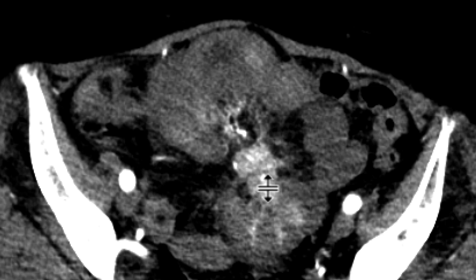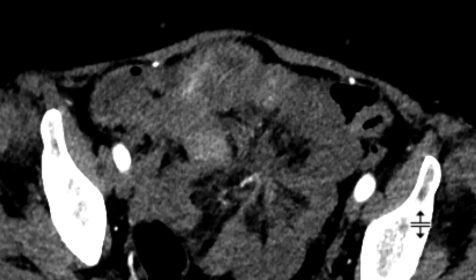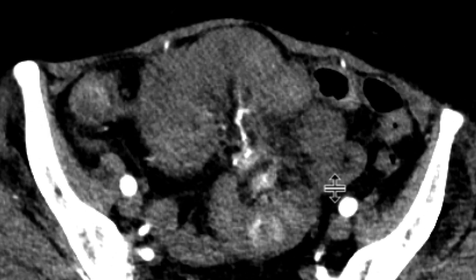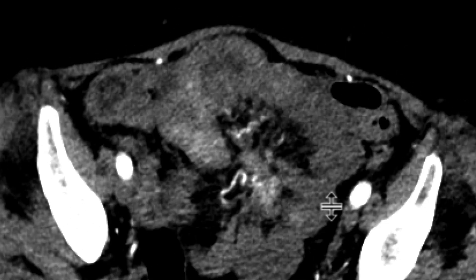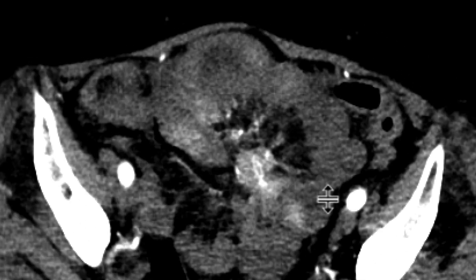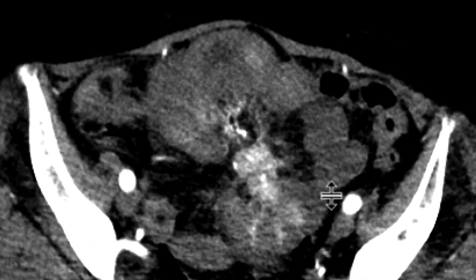Over here in the mesentery is the nodal metastasis from the carcinoid. It often results in tethering of multiple loops of small bowel, with spiculated margins and a few tiny calcifications associated with it, which we can see here. This is a great presentation of a carcinoid tumor of the small bowel with mesenteric nodal metastasis.